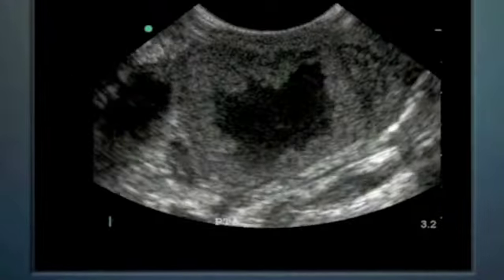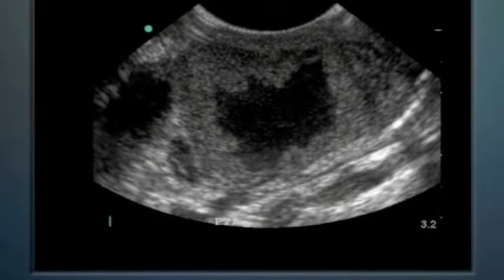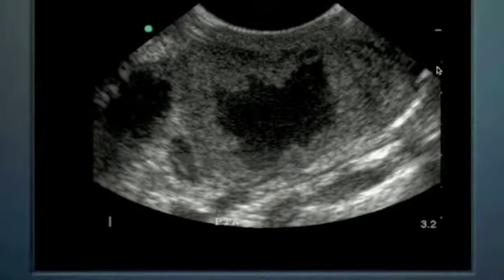This is a very large peritonsillar abscess. We see over here that these are 0.5 centimeter hash marks, so 0.5, 1, 1.5, 2, 2.5, 3, a little bit more gives us to 3.2 for the depth. And so this is measuring, anywhere from this mark all the way down to, this is about a 1.5, almost a 2 centimeter in its longest axis diameter peritonsillar abscess.